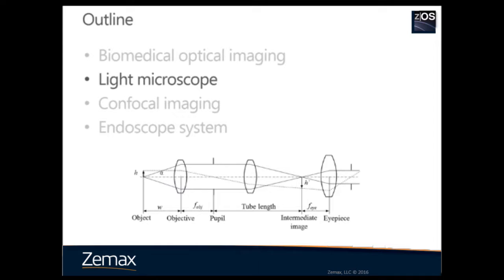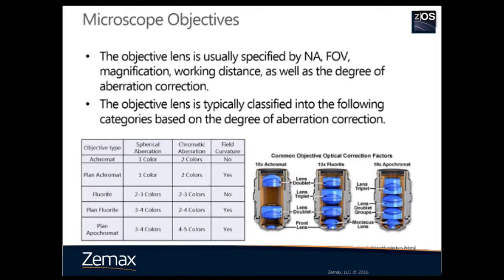Now let's discuss light microscopy with some ZEMAX examples. Microscopy is the most common optical system in biomedical imaging. While the microscope was invented 400 years ago, the principle is the same. The main difference between modern and traditional microscopes is the objective. Modern objectives are infinity-conjugate, meaning the image plane is at infinity, so we need a tube lens to focus the image into the intermediate image plane for cameras. To design an objective, we need to know the numerical aperture, field of view, working distance, and degree of aberration correction. Objectives are grouped into categories based on correction of spherical aberration, chromatic aberration, and field curvature.